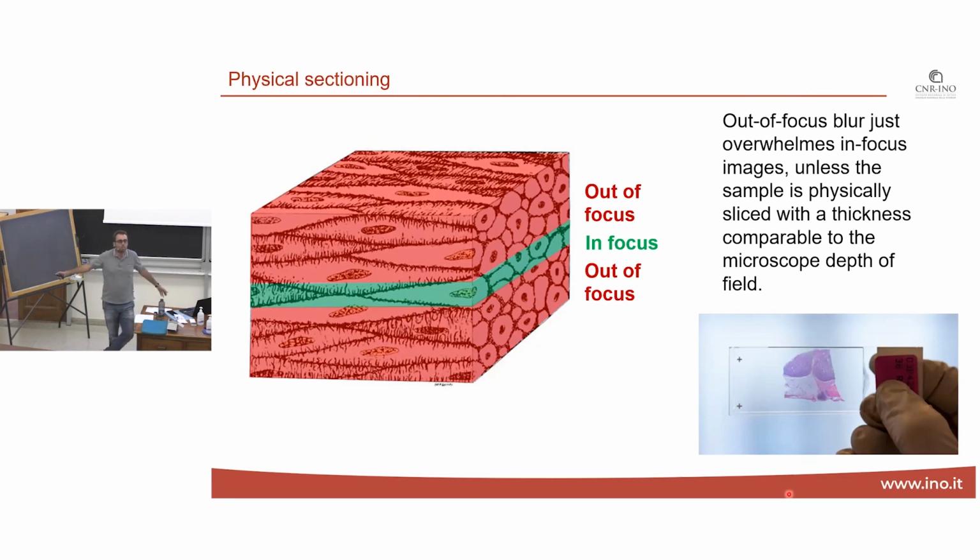This is a simple, perhaps useless transformation. Probably not so, because anatomopathologists are used to looking at samples that are stained like this. And since our fluorescent stains mark the very same structures that these pigments are marking, we can create a three-dimensional view of the sample, in this case a human bladder, but with the coloring of traditional microscopy, which is what the physicians want to have when making their diagnosis.